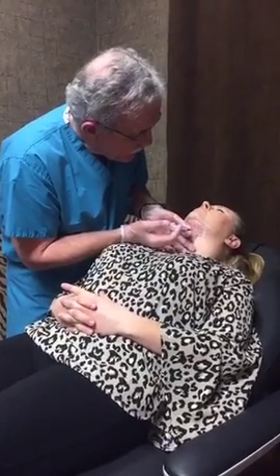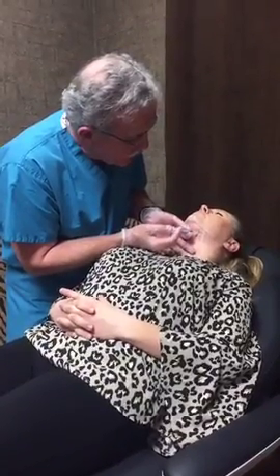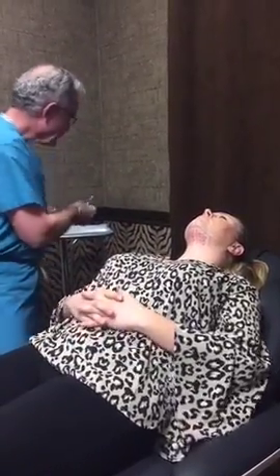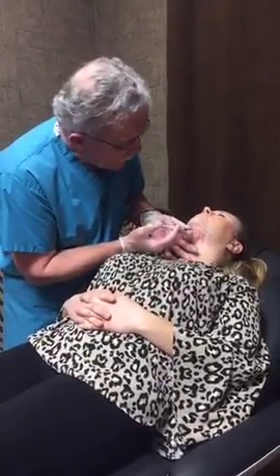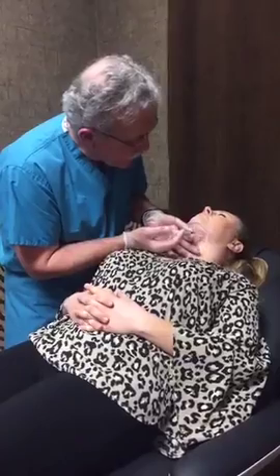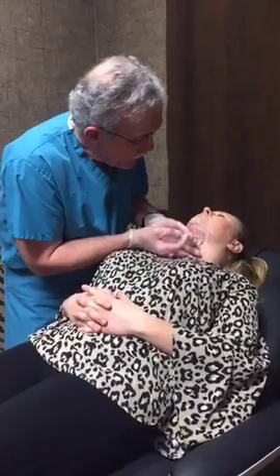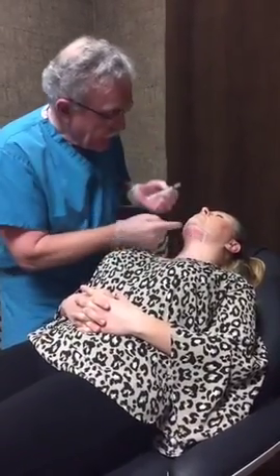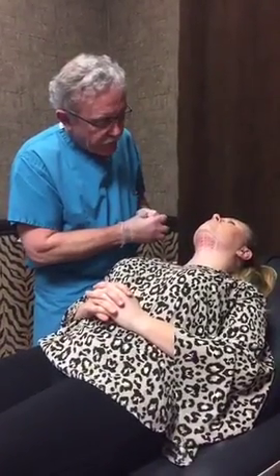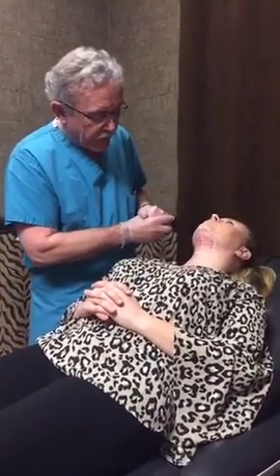Dr. Anderson, can you describe the perfect candidate for this procedure? The question is, who's the perfect candidate for this procedure? And that would be somebody who has relatively firm skin under the chin, so an 80-year-old person would not be ideal. I'm just going to add a couple little over here. So you want somebody who's got an isolated fatty deposit in the neck, right here under the chin, basically your classic double chin, and you want skin that's going to be tight enough that it's going to retract back up.